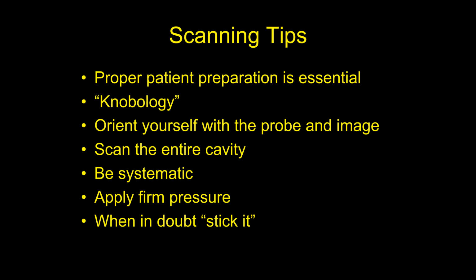And that's when you have to decide, well, what kind of vet are you going to be? Are you going to be a half-ass vet that does things half-ass ways? Or are you going to stand up for what's medically right and say, you know, if you don't want me to clip the hair on your dog, I'm not going to get an image. So then we're not going to waste the time and money to ultrasound it unless you give us permission to clip the hair. Okay. So you need to clip the hair when you're getting ready to do an ultrasound.